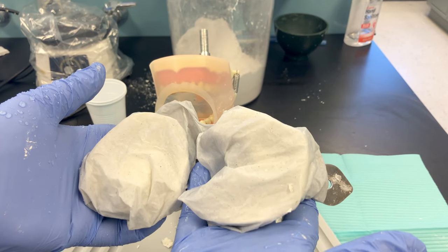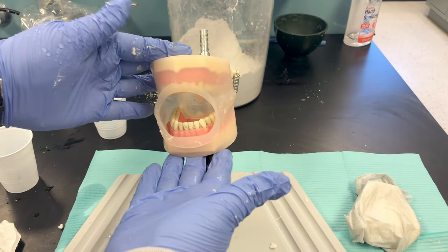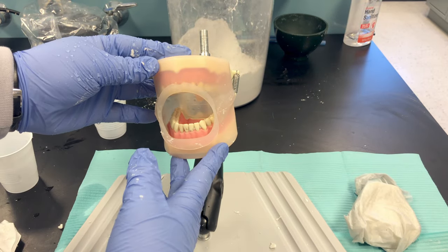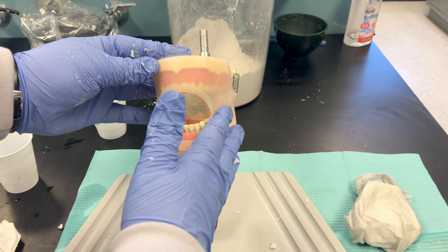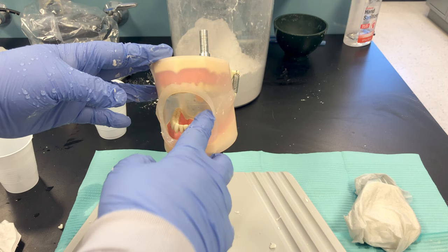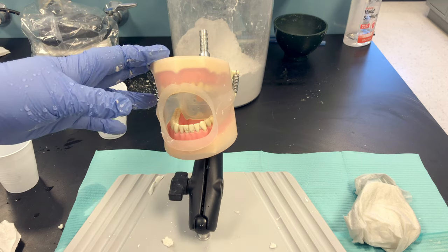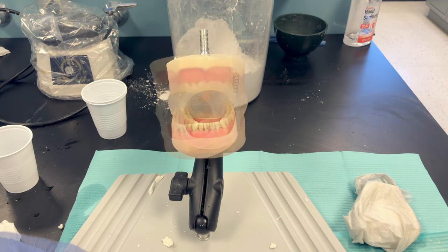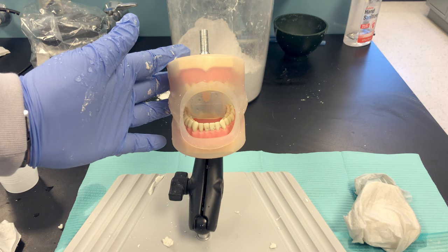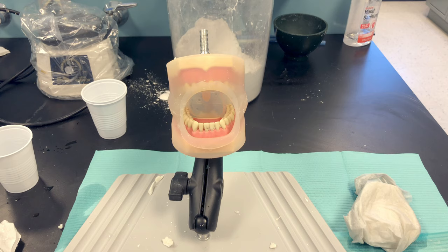Now that I have both impressions wrapped, I can take them to the lab and pour them up after dismissing my patient. Assist your patient in cleaning up — a damp towel to wipe their face, help with flossing, a complimentary toothbrush, and mouth rinse to get excess alginate out. So there you have a demonstration on alginate procedure — hopefully it's been helpful and can improve your technique.